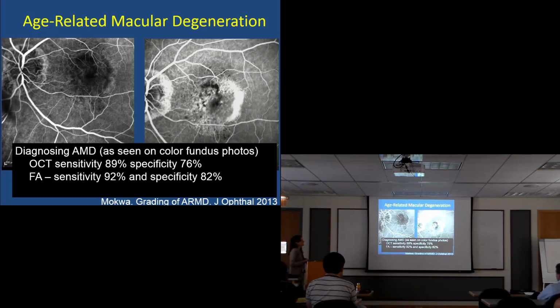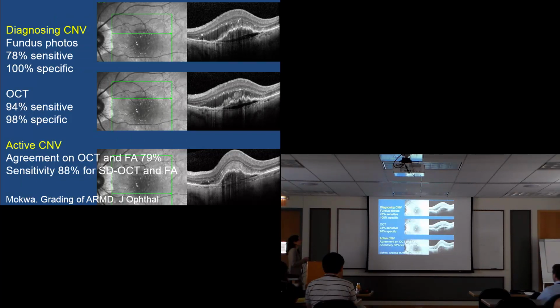So patient with AMD, this is where it's showing us when they did these studies, the numbers behind it, the OCT sensitivity, and knowing if a patient has AMD, any kind of features from clinical comparison, pretty good, but still everyone's favoring the fluorescein angiogram. The advantage is the OCT is non-invasive, and the fluorescein is really you put a needle in someone's arm.